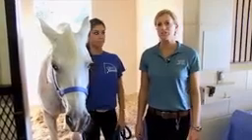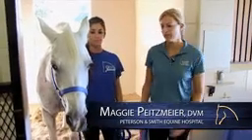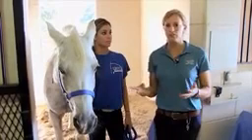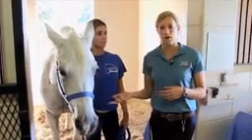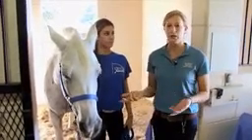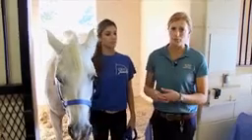In this portion of administering medications, we'll be talking about nasogastric intubation. The most common time you're going to be tubing a horse is for colic reasons, and you're either going to be passing the tube to reflux the horse if they have too much stomach contents, because horses are not able to vomit, so we need to actually pass the tube in there and relieve that pressure off of the stomach. The other reason you might be doing that is to administer things like oral fluids or mineral oil when they're colicking to try to loosen up their stool.